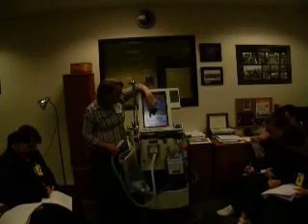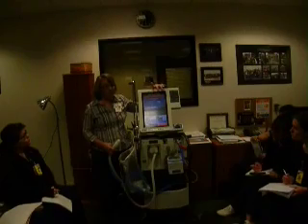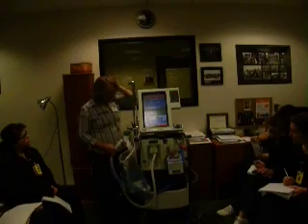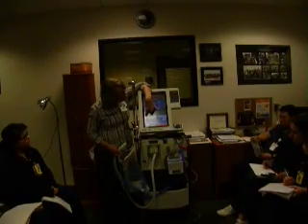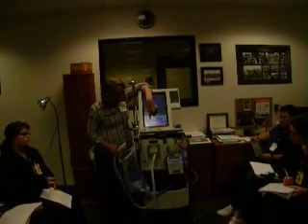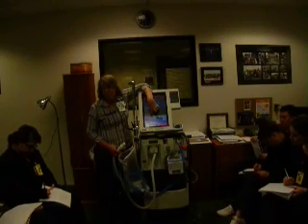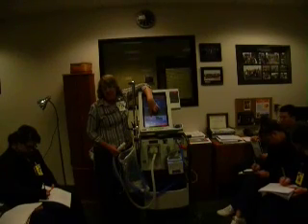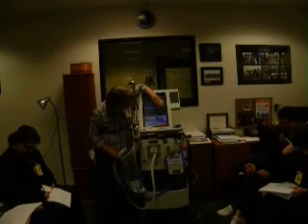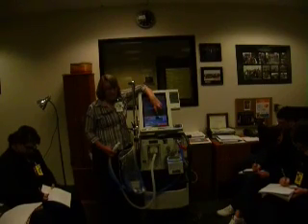So here we have, and I just want to point this out because this is about to change, at the top it still says vent startup in progress. That means we're still setting the vent. You can see that we have our AC, VC, which we've already said we wanted, flow trigger, and so here we can set our frequency at 10, our tidal volume. V max is the flow on this ventilator. V with a dot over it, then the word max, is flow on the PB 840. And then V sensitivity is our flow trigger where we're going to set that.